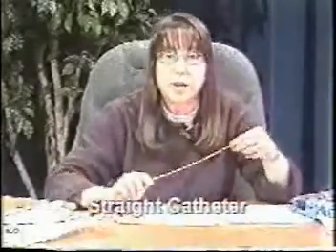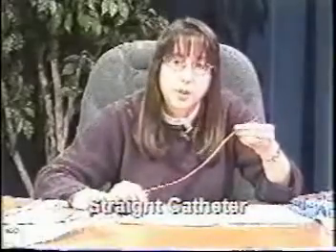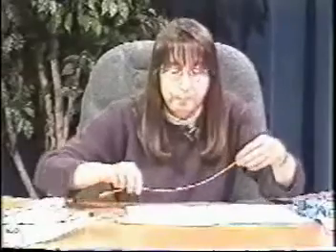I'd like to discuss the equipment that is used for the urinary catheter patient. We have different types of catheters. This is a straight catheter, and this is the one that is used to insert temporarily into the bladder. And it is used to obtain a urine specimen or to just empty the bladder of urine. When the patient has to have continuous urinary drainage, they will have a Foley catheter. Sometimes it's called an indwelling catheter or a retention catheter. And this is what the catheter looks like, and it will remain in the bladder.